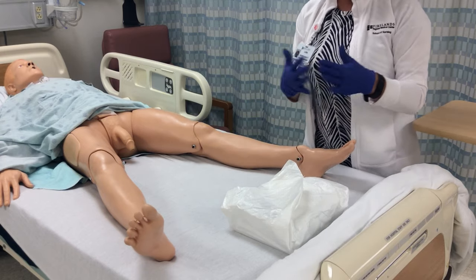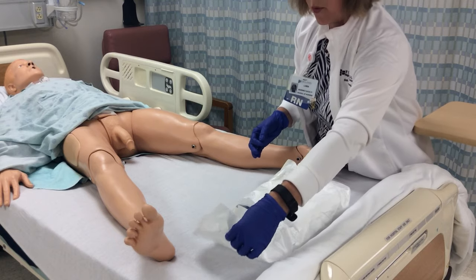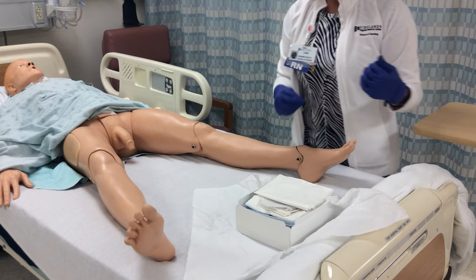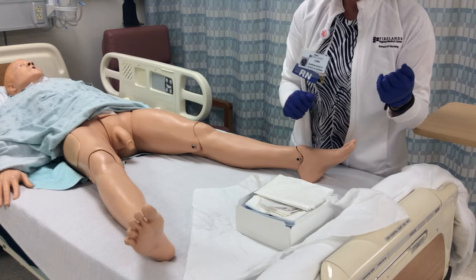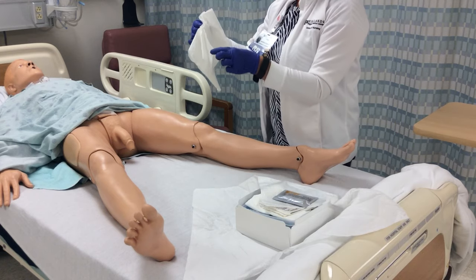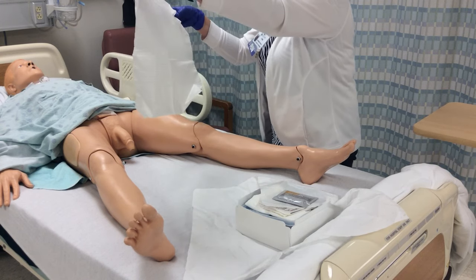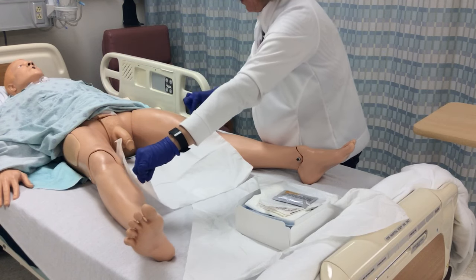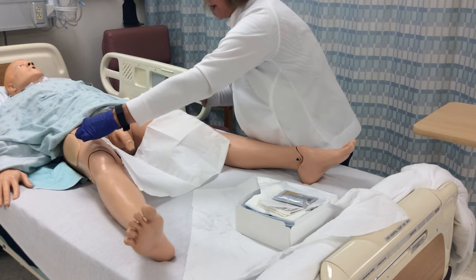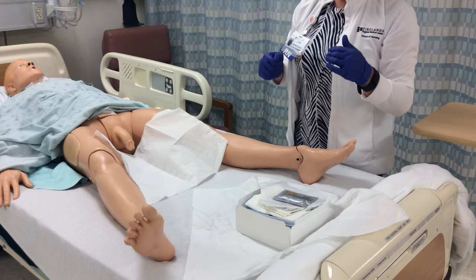After opening the sterile catheter tray, grasp three corners and open just three of the corners to begin with. With clean gloves on, grab the drape from inside the catheter kit, touching only the edges of the drape with the shiny side down. Place the drape between and over the patient's thighs, and also under the penis.